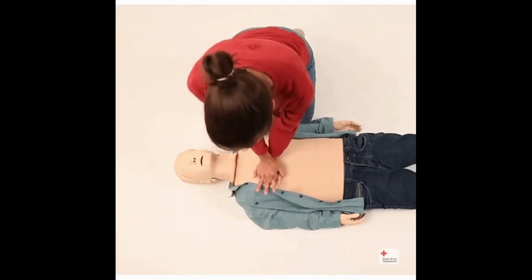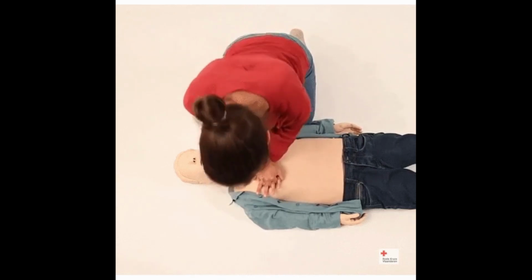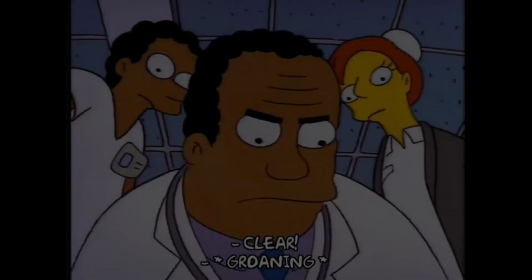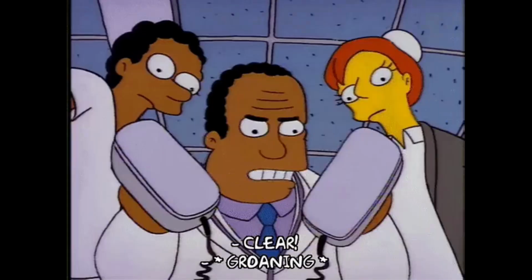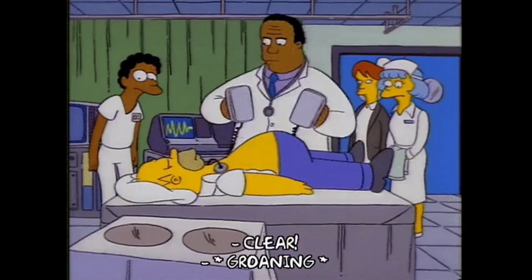6. Shock the victim if necessary. If the automated external defibrillator advises that you need to shock the patient, you need to make sure, once again, that the victim is clear. Once you do, push the shock button on the automated external defibrillator. This will send an electric shock through the electrodes to help restart the heart. The automated external defibrillator will only give 1 shock at a time. It doesn't last that long, but expect them to move with the force of the shock.